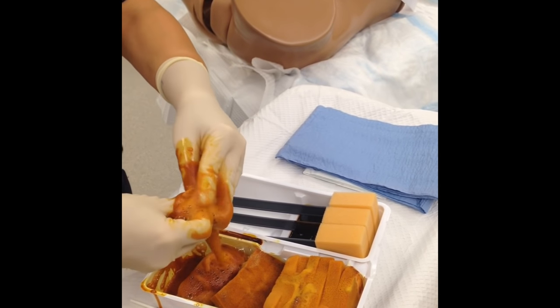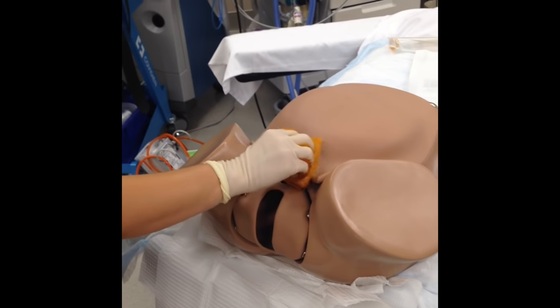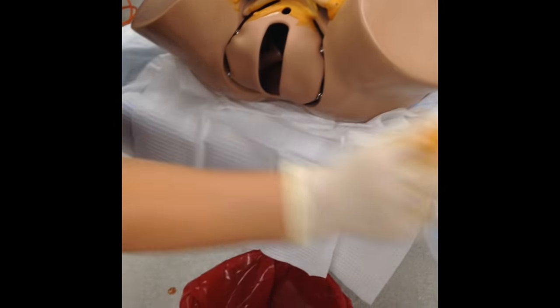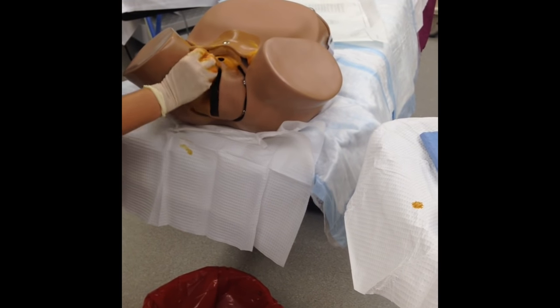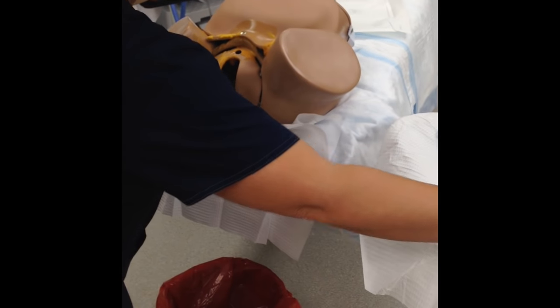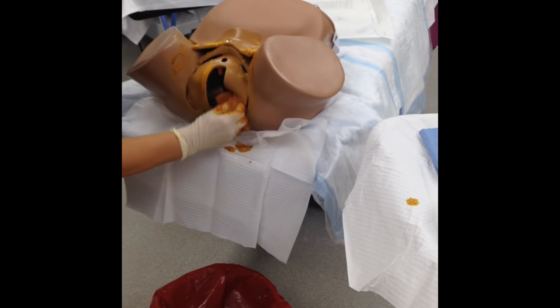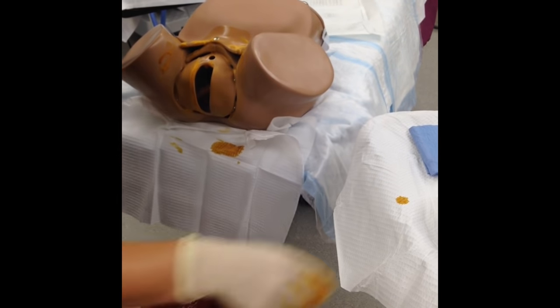First thing we're going to do is take off the excess prep. We're going to start at the mons pubis with scrubbing motions, back and forth, then discard my sponge. I'm going to start on either side. The reason we start on the vulva is because this is the area where we're going to be doing our surgical case, so this needs to be the cleanest part. Once that's done, discard and go to the other side — you do want to scrub. If you do touch the anus, go ahead and discard that sponge and get a new one.